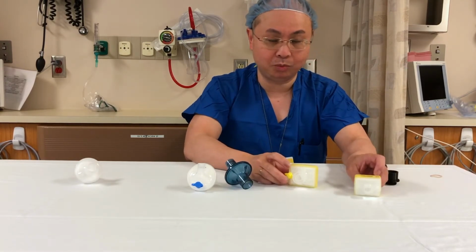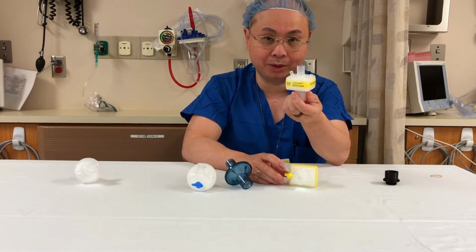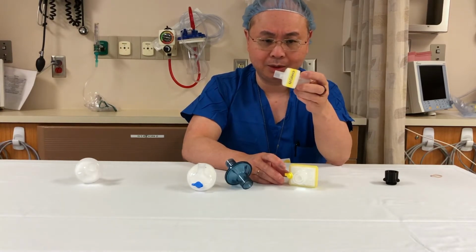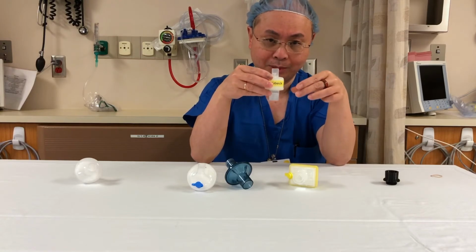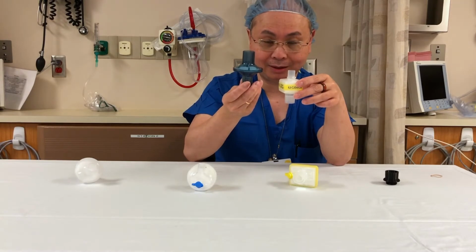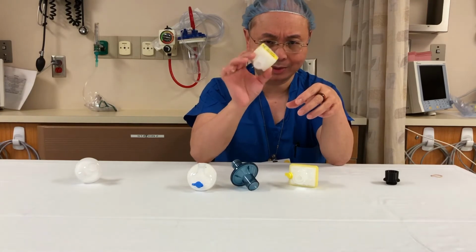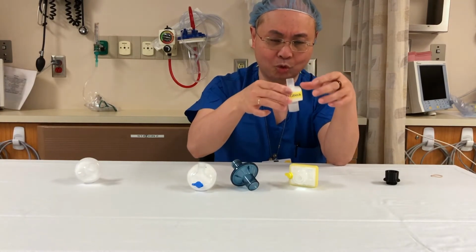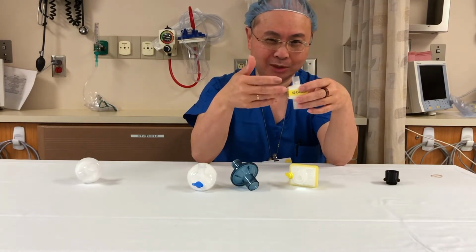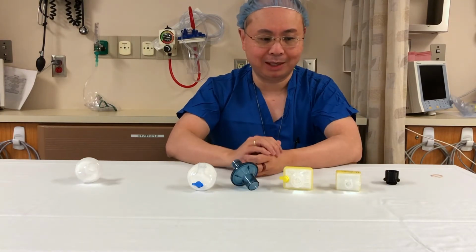and are stuck with something like this that has really marginal flow characteristics, there will also be an STL available in the files soon so that you can put two filters in parallel and effectively get a lower resistance, like on the low resistance filter, even though you have a high resistance filter. Two of them in parallel will drop the flow resistance in half almost. Unfortunately, of course, that means you're using two filters simultaneously, so it may be an issue in terms of supply.